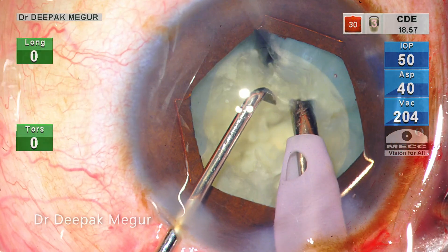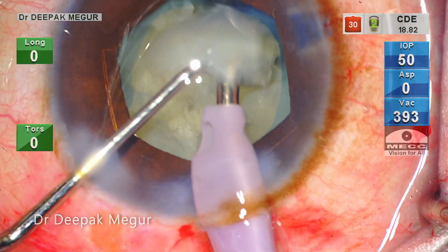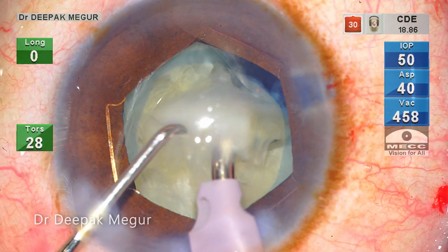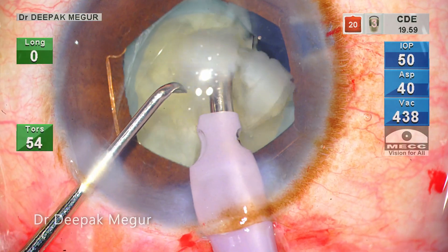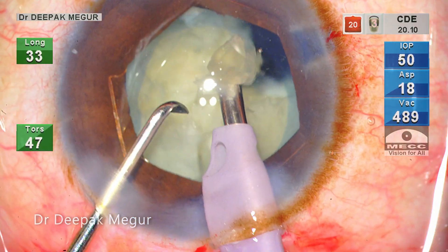Once the first chop is done and the fragment is loose, I want to get the first piece out of the bag, as this will create some space inside the bag which will in turn reduce any stress on the extended or torn capsular margin. The fragment is emulsified in the anterior chamber.